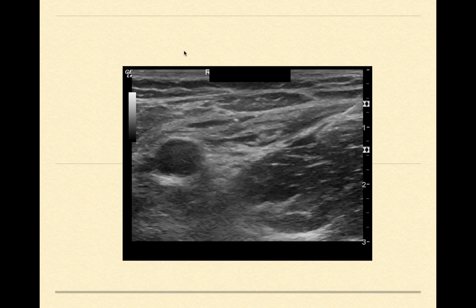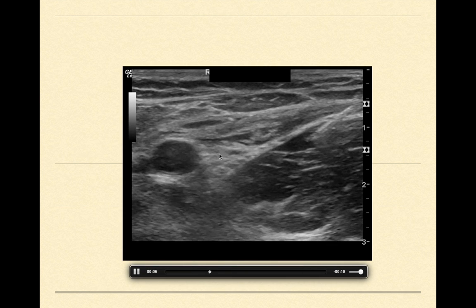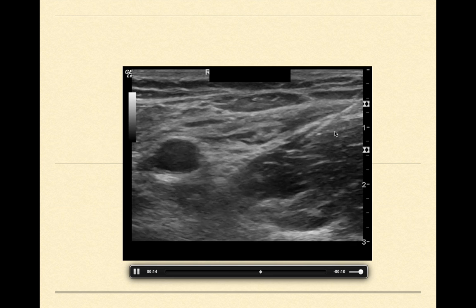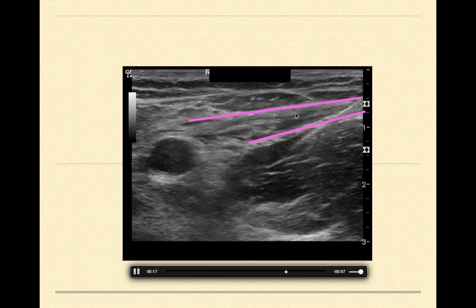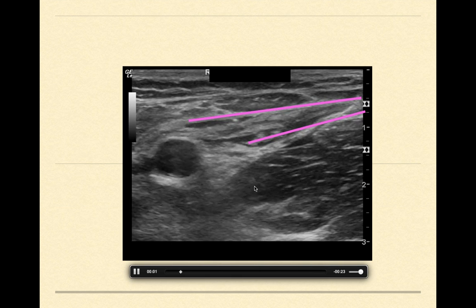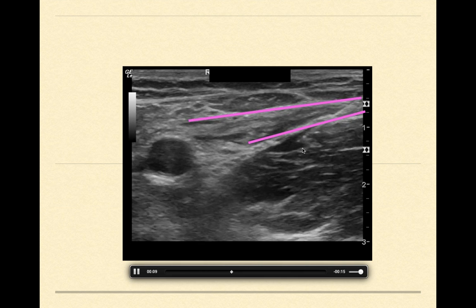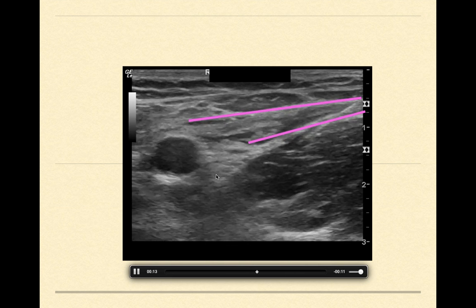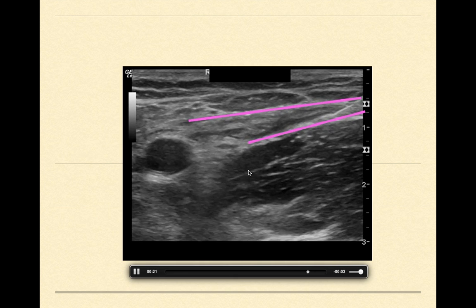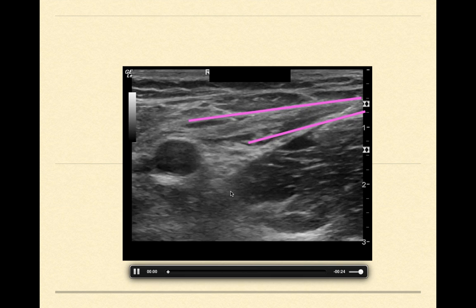So in this image, this is actually the left side of the patient. The last one was the right femoral bundle. Here's the left femoral bundle. Again, nerve in the middle of your screen. Here's your artery, your veins compressed over here. Lateral side of the patient, you're entering with your needle, following your probe, piercing through both your fascia lata there on top, as well as your fascia iliaca here. So fascia lata, fascia iliaca, needle going through both, giving a nice pool of anesthetic just underneath that fascia iliaca, which is optimal. That way, giving this 30 cc installation will give you good diffusion or dispersion to this nerve, as well as hopefully your obturator nerve and your lateral femoral cutaneous nerve, which are the three major nerves that serve the hip and provide pain relief.